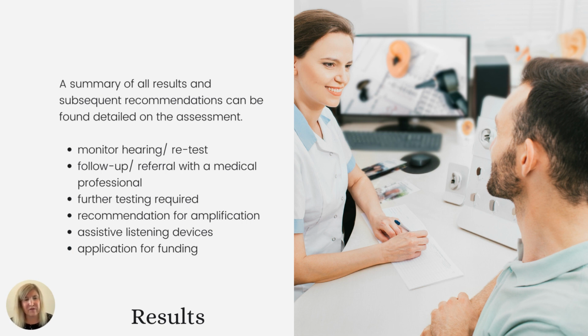The examiner may recommend a follow-up or a referral with a medical professional to see if there is something that needs to be medically addressed with the hearing loss and the ear. Further testing could be required. At some clinics, they don't have all of the equipment, or further equipment is required from a public health unit.